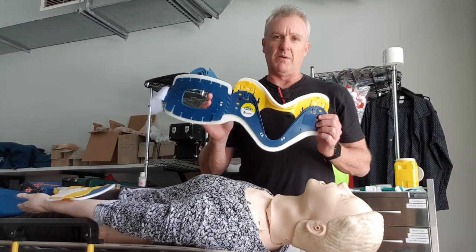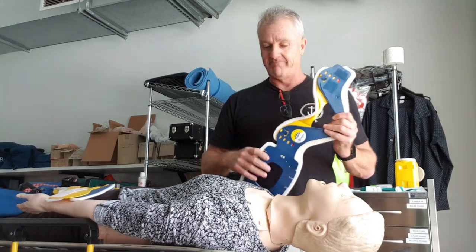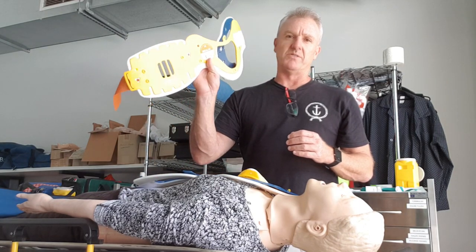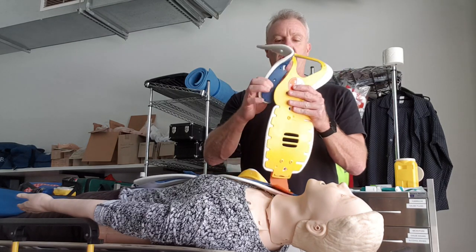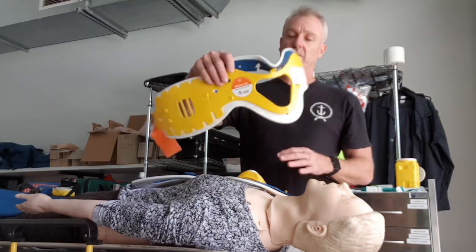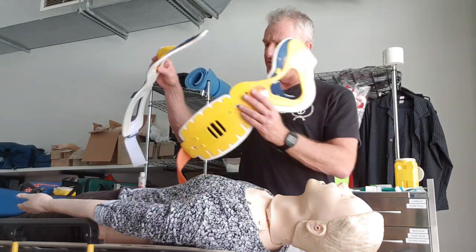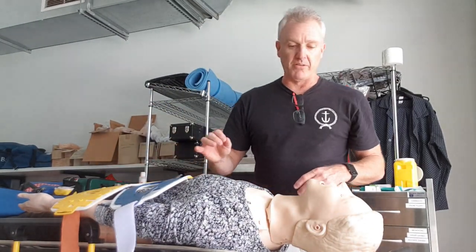In our kits we have two types of collars: we have the adjustable collar and also the single-sized version. This one's a regular where we put the peg there in the sizing hole. This is probably the one you're more familiar with — the version that you see out on the road in clinical practice. So I'll quickly show you both today.